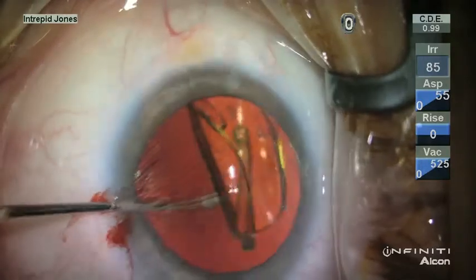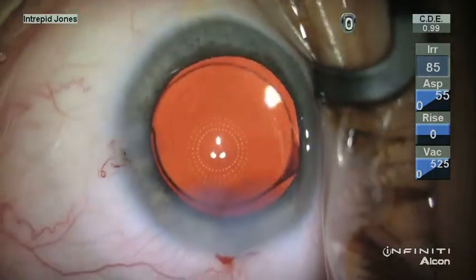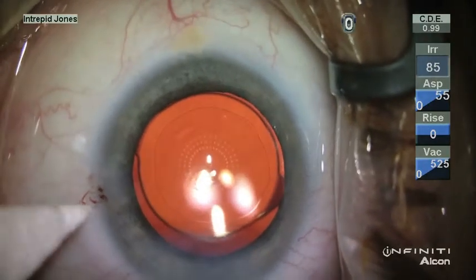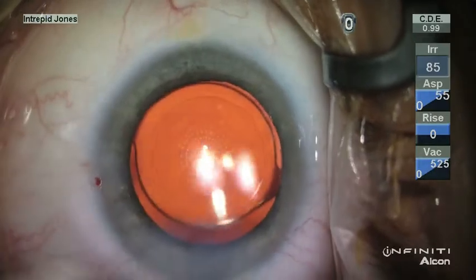Once the lens is in place, and with an inflated anterior chamber, you can notice this lens sits more nasally, and the keratoscope confirms that it is well centered on the visual axis.